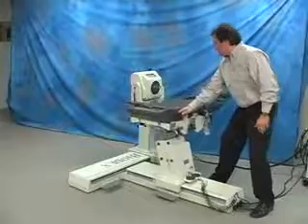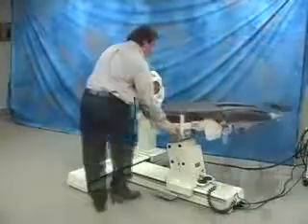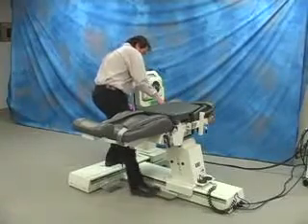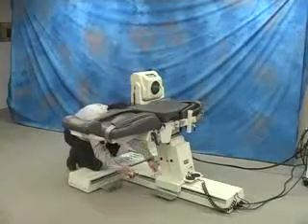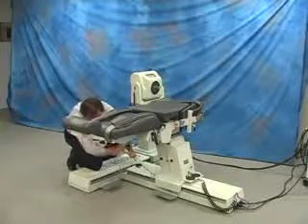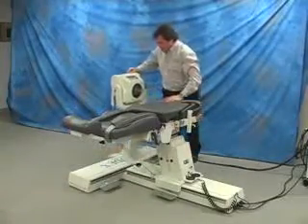To set the opposite side, rotate chair to the opposite 0 degree position. Reapply chair stabilization bar. Move dynamometer into position.